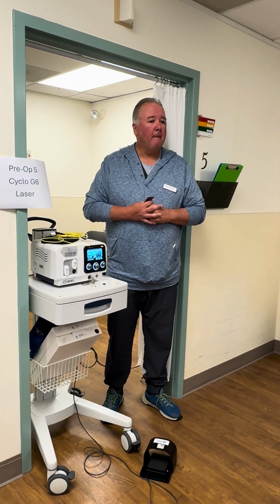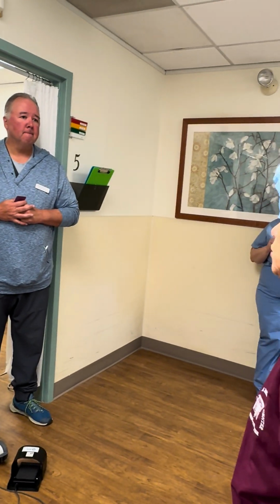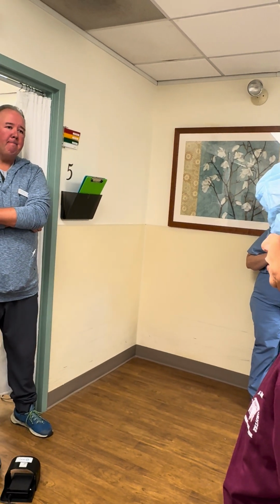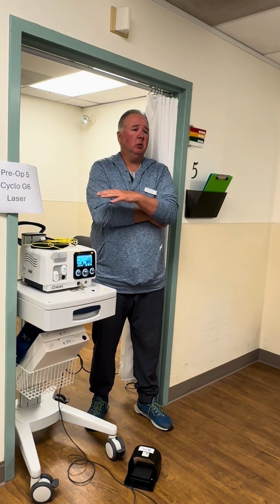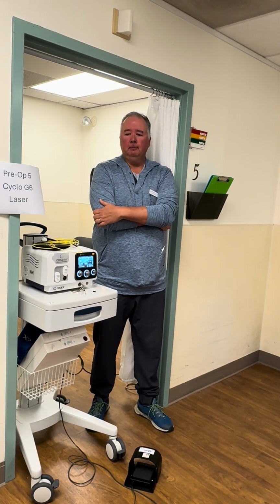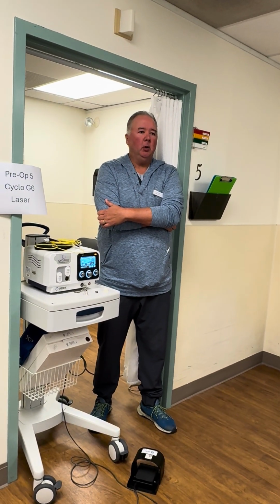If you're in the room, don't pull the probes. The doctor will, because they're usually not sure which one they're using until the day of, and Dr. McLumpy will pull the probe, hook it up, and do her own settings the whole time. She's pretty self-sufficient. Yeah, and most of them will. And the settings are in there with the most common. They may just alter those a little bit. Most of the doctors in the centers are adjusting their own. They know what works.